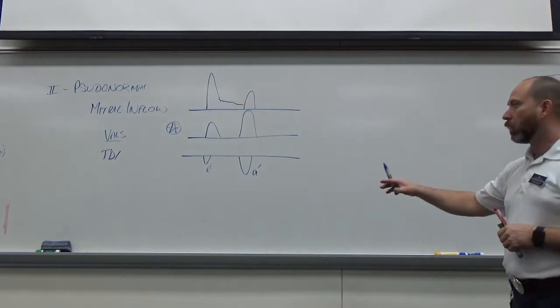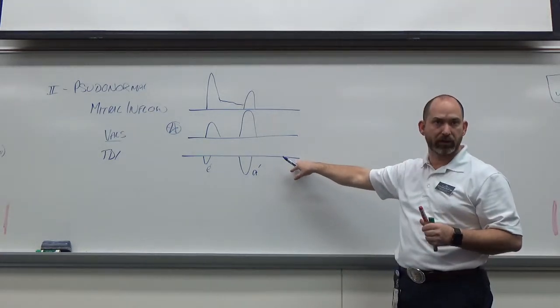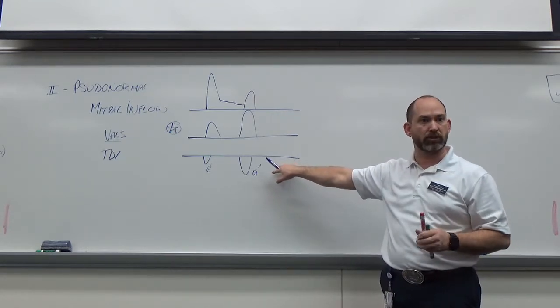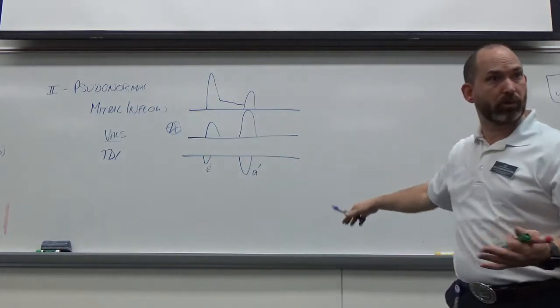Okay. Now, as this same patient, if I'd scanned them 15 years earlier and they had some impaired relaxation, it still would have had this EA relationship. Okay, it would have been impaired back then. So it pretty much stays this way throughout now.